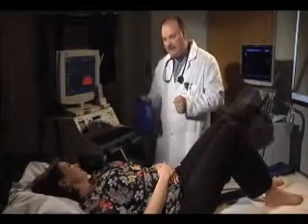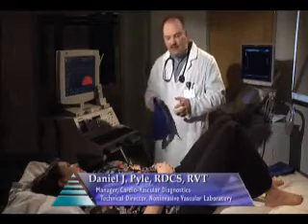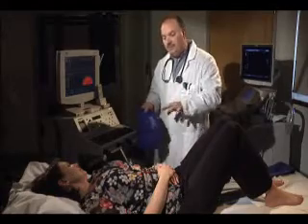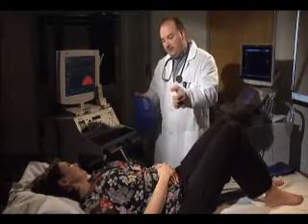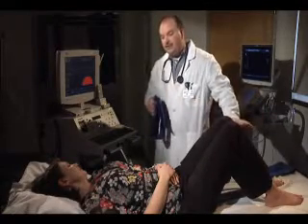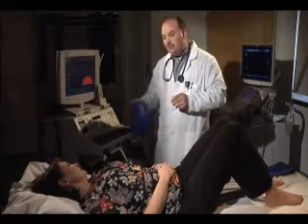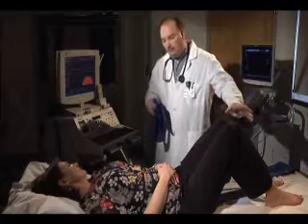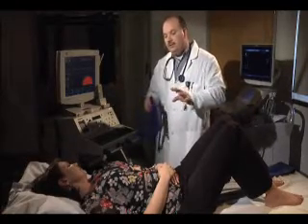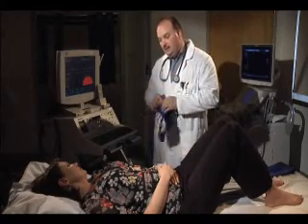The next test we're going to do, Amy, is an ABI study. That stands for ankle brachial index. An ankle brachial index is a procedure where we'll place blood pressure cuffs on both arms and on your ankles. We'll check the pressure and blood flow in your arms, and then compare that to the pressure and blood flow in your ankles. If the blood pressure in your ankles is higher than that in your arms, that's a normal finding. If the blood pressure in both legs or one leg is lower than the blood pressure we find in your arms, that tells us there's a blockage somewhere from the heart in the vessels that lead down to the legs and the feet.